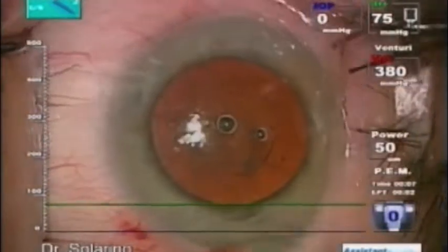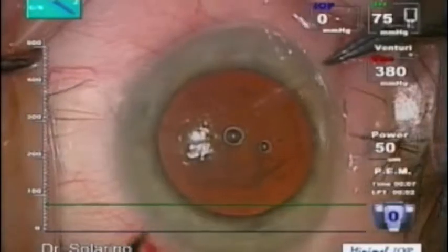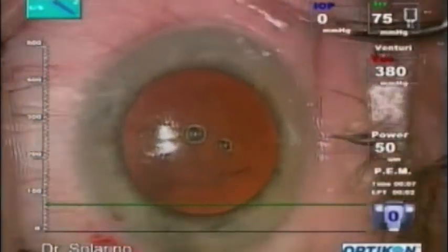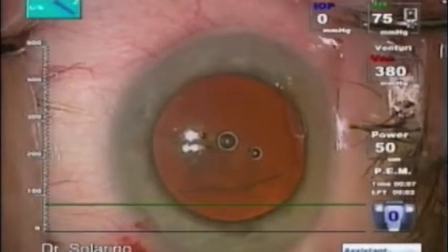We made the side port. The patient is on Coumadin, so it is easy to have a little blood.